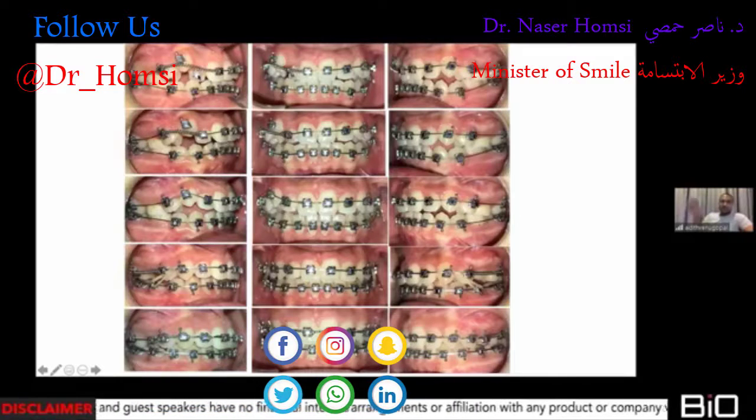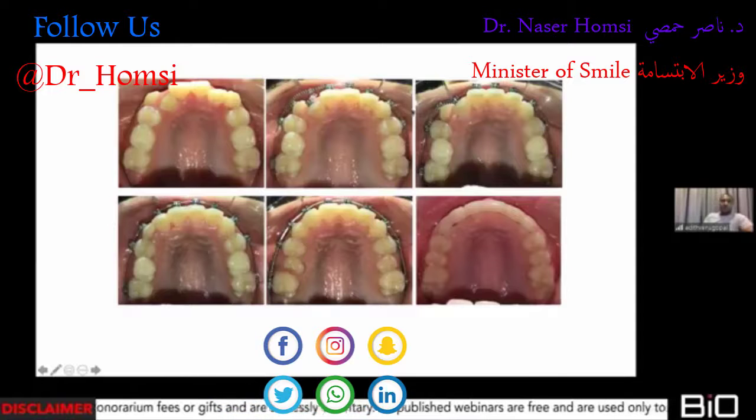You never do in such cases, because that just proclines the lateral incisor way out and pushes the root back onto the canine, and you'll have torque issues. So I wanted to gain some good space. Once I gained good enough space, I engaged the lateral incisor and started getting space for the canine. Finally, I got the canine down as well, and I was waiting for this primary tooth to come out and the fives to erupt. Once that happened, I maintained the space with an open coil spring, simultaneously corrected the overjet using class 2 elastics, which definitely proclined the lower incisors forward in this case, because that's exactly where the teeth would go. And as you can see, I was able to slowly gain space.